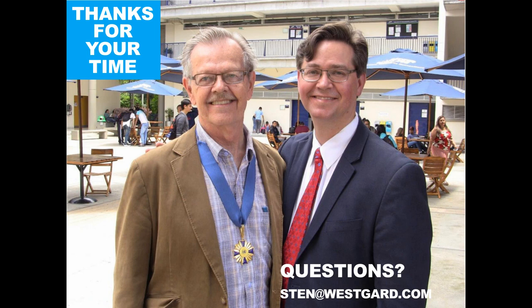But if that's the only way you can determine bias, my opinion is you should go ahead and do that. It's not a great amount of data, but it's your only data on bias. You should go ahead and use it. If you would find more comfort and more robust stability in a peer group mean versus observed mean determination of bias, I would encourage you to use that.